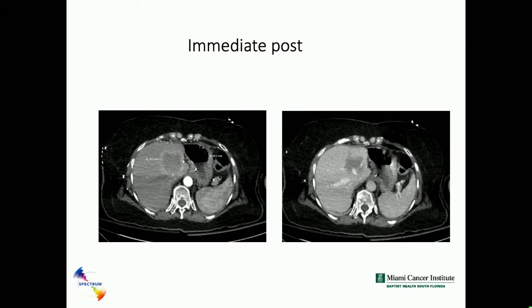So when you're using 3 needles, even though you have 3 needles, it goes from one pair to another. Therefore, you can use an even number of probes or an odd number of probes. It does not matter. So here's another example of the immediate zone. What I wanted to highlight on this is the size of this ablation zone after we were finished.